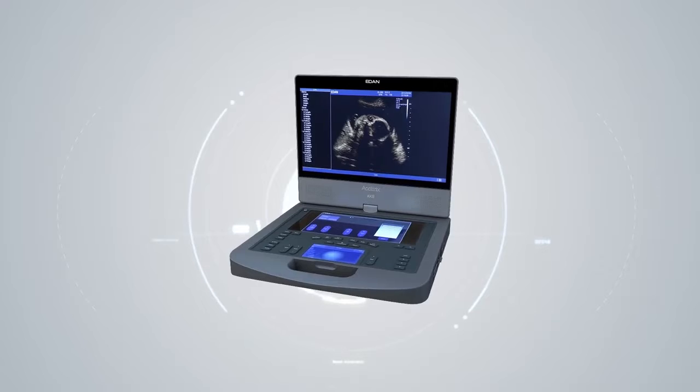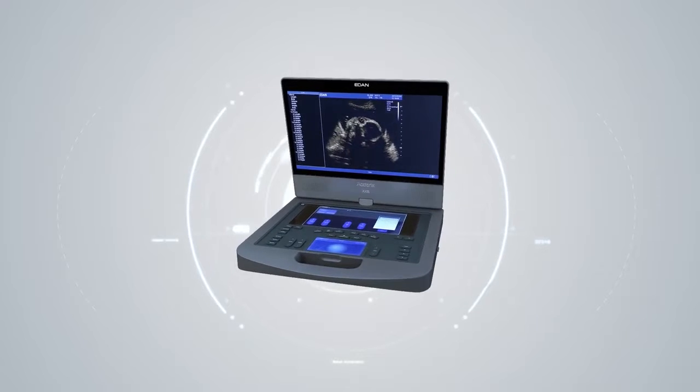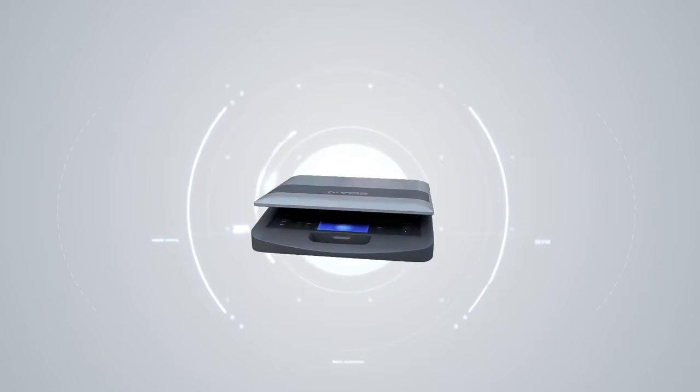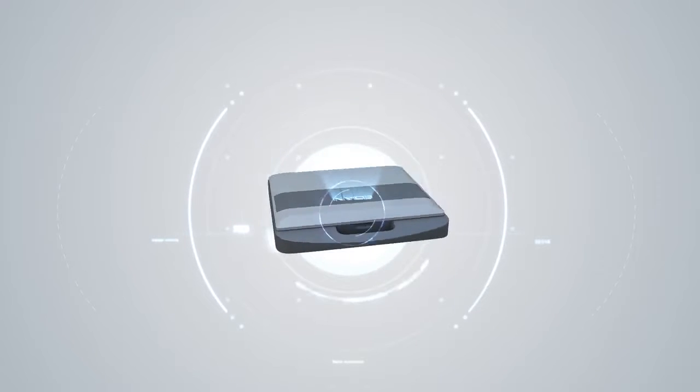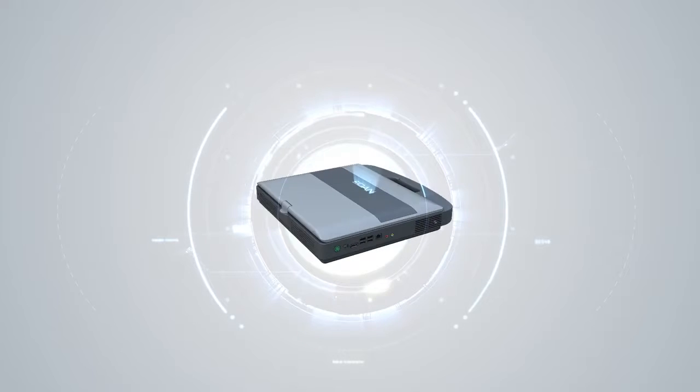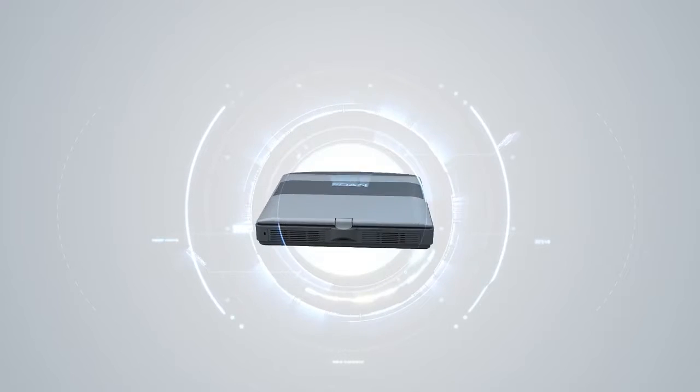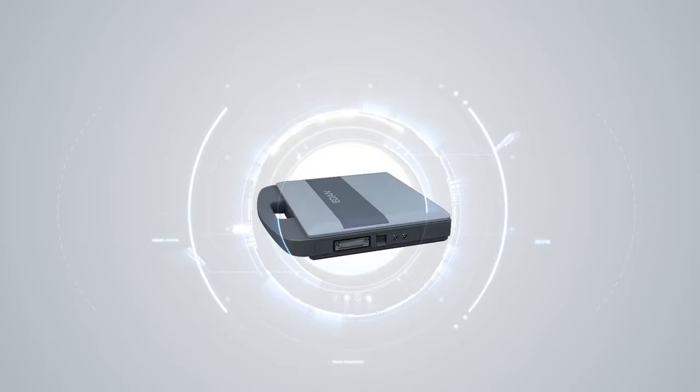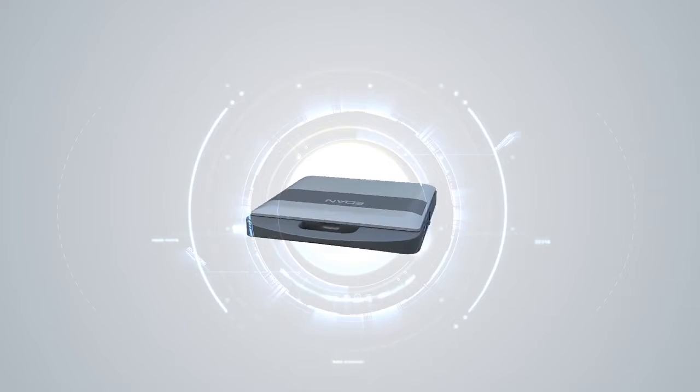Welcome to the Acclarix AX8, Eden's Premium Performance Compact Portable Ultrasound System. The Acclarix AX8 is the result of Edan's commitment to and investment in ultrasound.